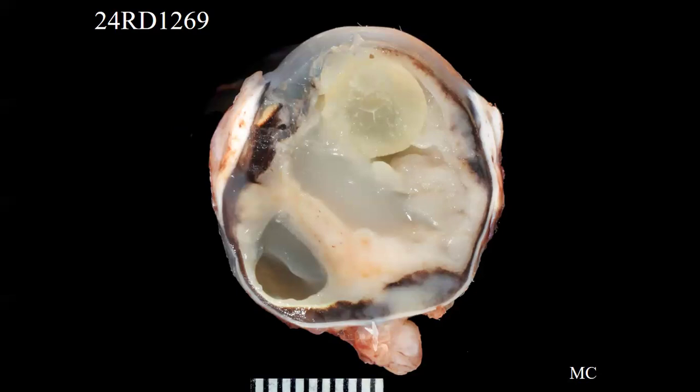So that's interesting. In the gross view here, this ventral mass effect is mostly associated with an anteriorly positioned iris leaflet. You can kind of make out the iris leaflet by its pigment here. And then there's all of this inflammatory exudate just behind it. And the lens is unstable. It's basically luxated and sort of pushing forward as well. So that mass effect is basically the bulging of all this stuff forward. And then the rest of the eye is pretty well full of tan to white exudative debris as well. And you can see that the uveal tract itself is a little bit thickened and distorted. So a pretty heavily inflamed, unhappy looking eye.